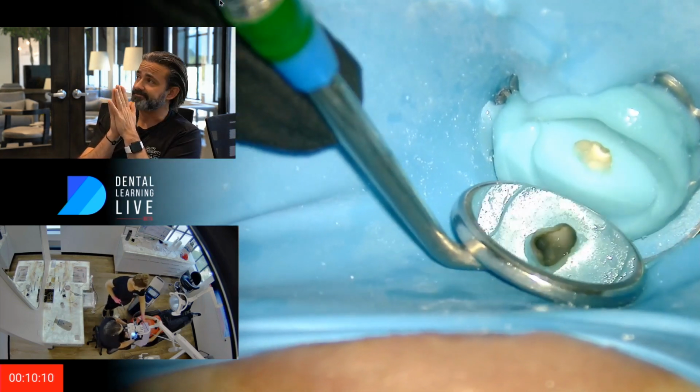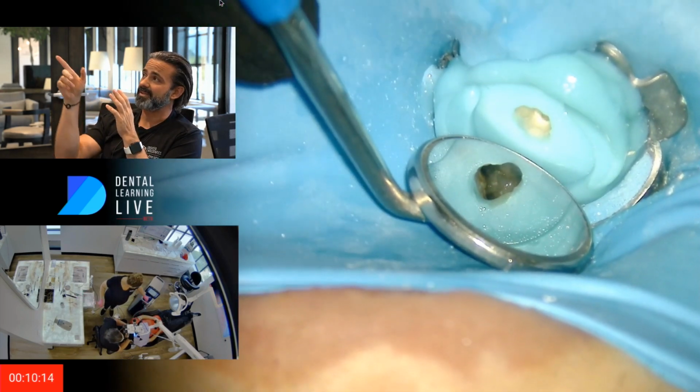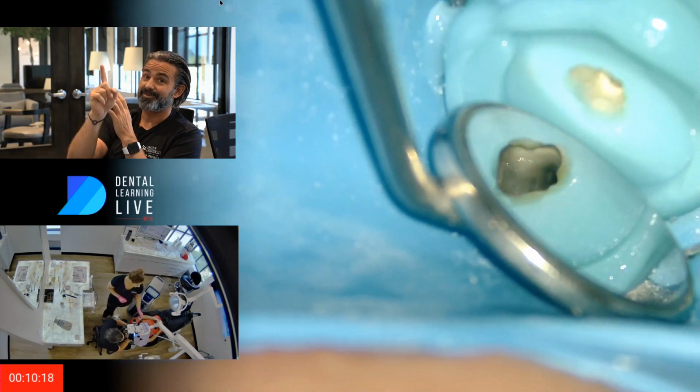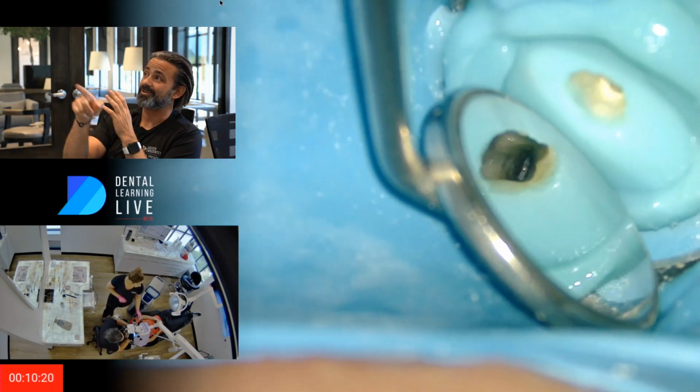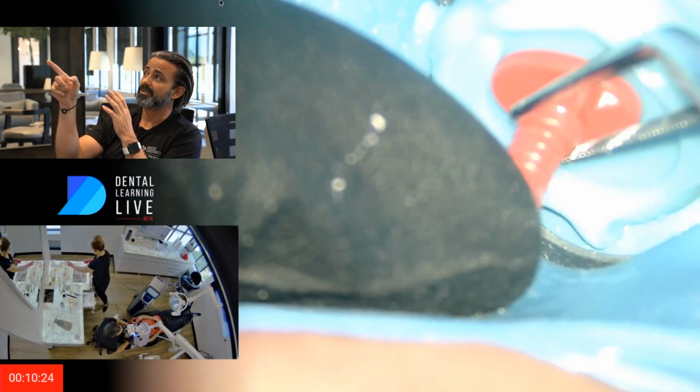Ten minutes into this case. So what have I done? I've accessed, picked out stones. I found the anatomy. You can appreciate the isthmuses, because we knew it on the mesial, but there's definitely one right there. Did you see it? On the distal as well.